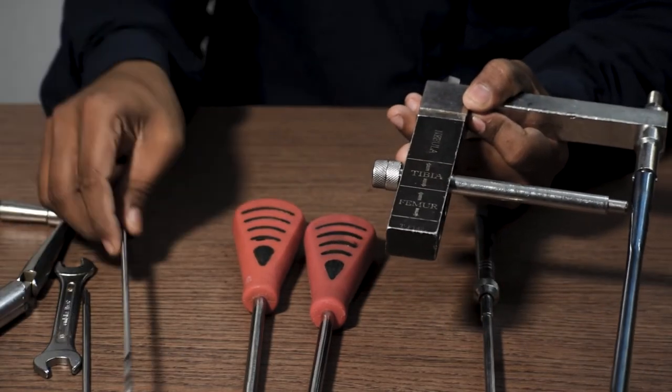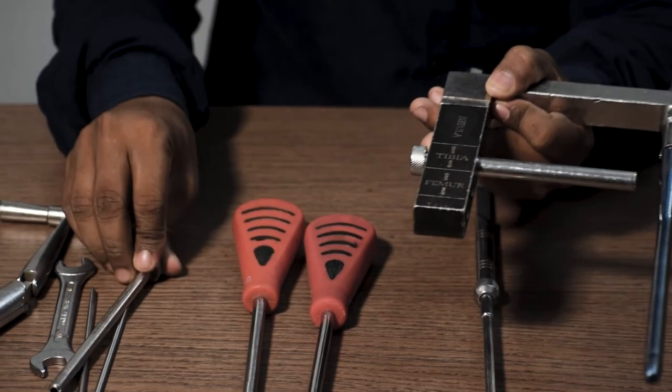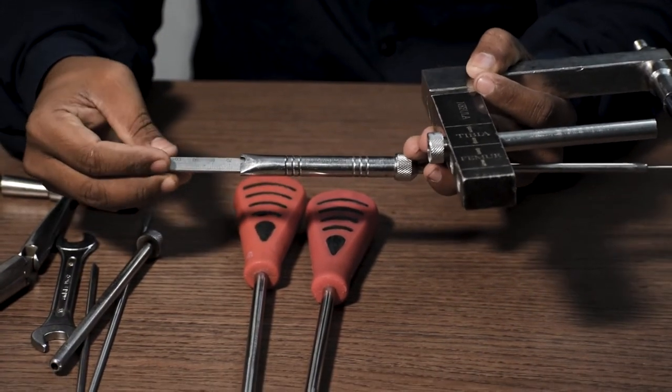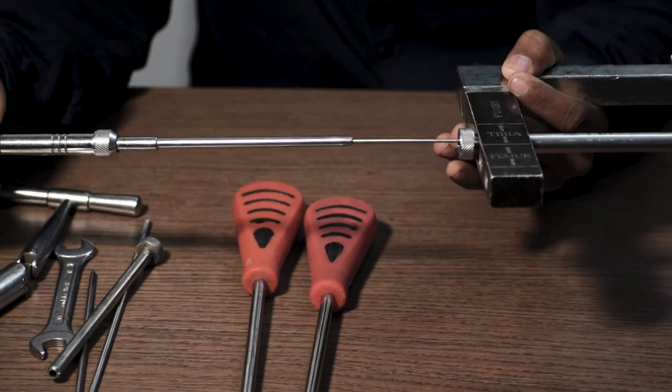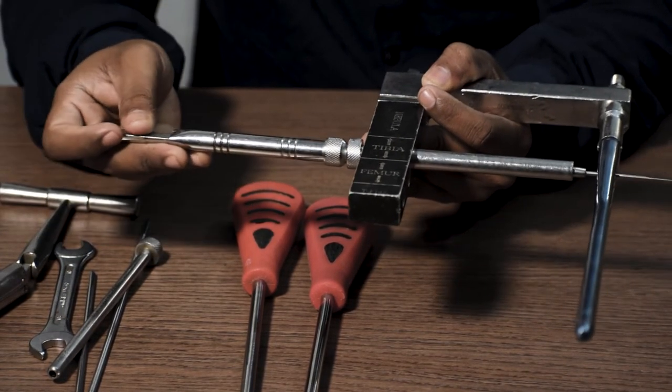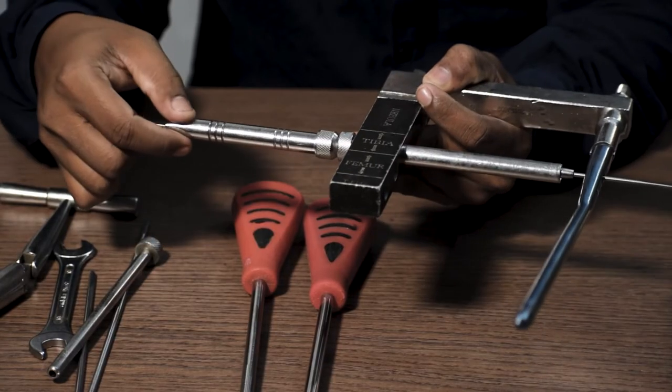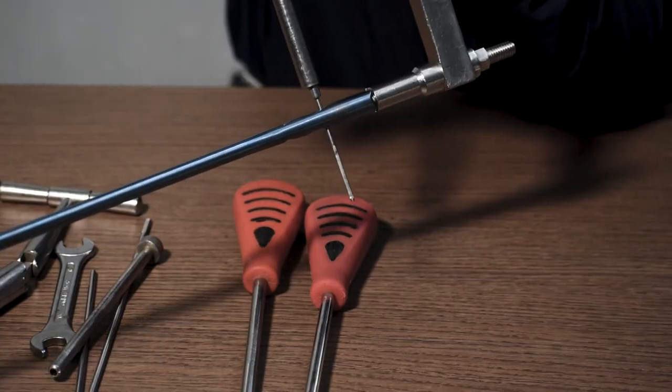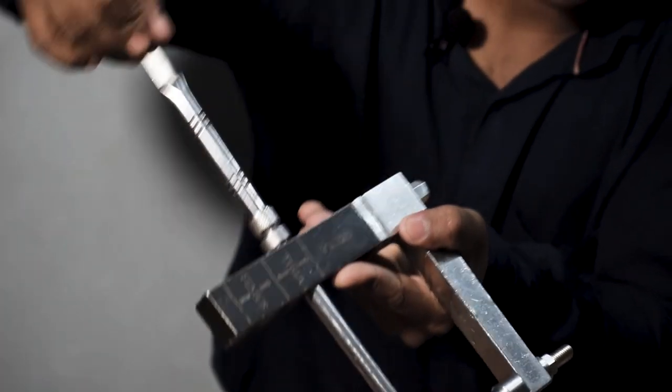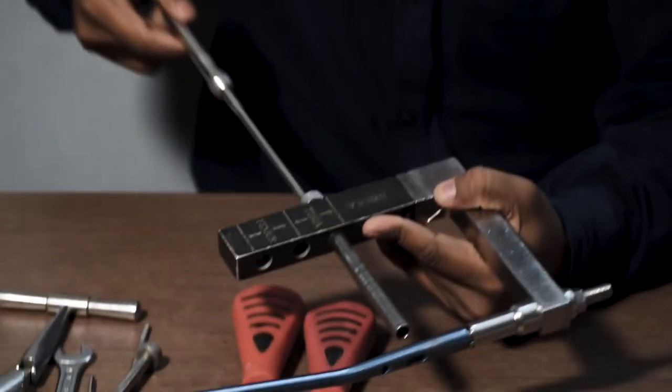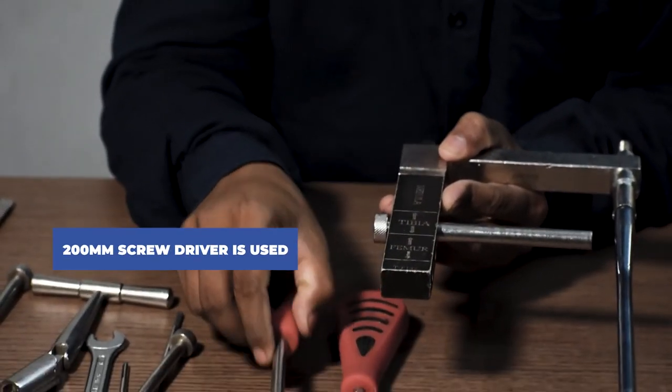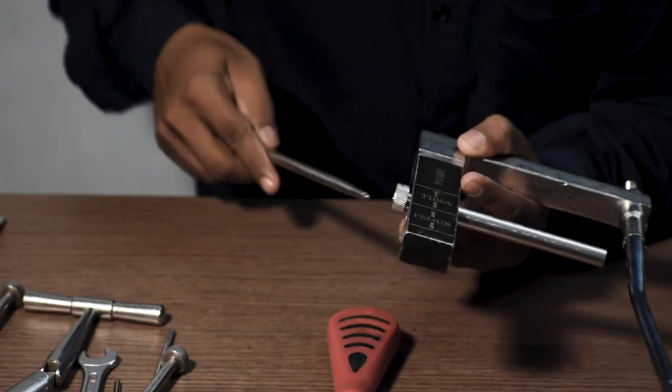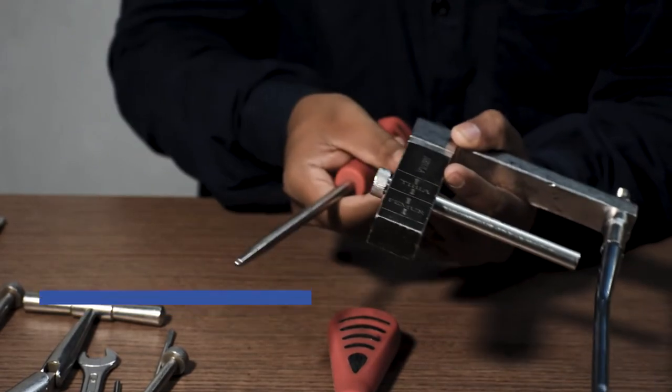After that, drill sleeve is taken out and depth gauge is used to measure the length of the interlocking bolt which is needed to be fixed. It is inserted through the protection sleeve and checks the depth of the hole to have an idea of the length of the interlocking bolt needed.